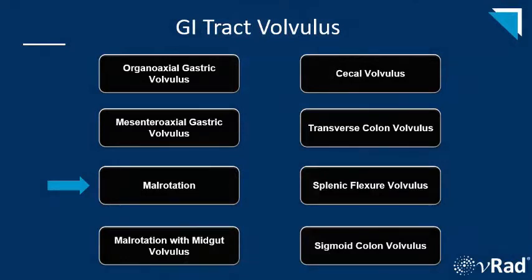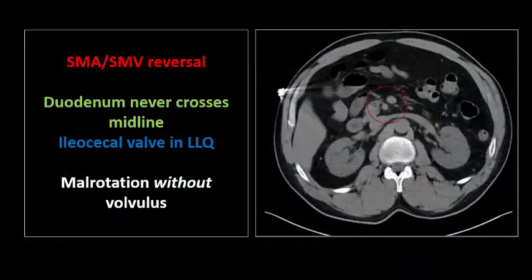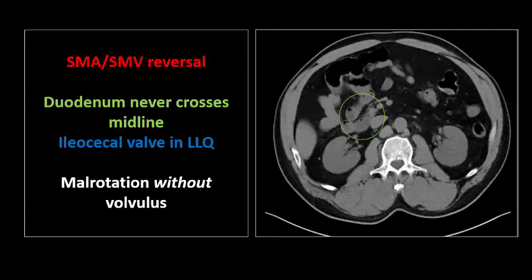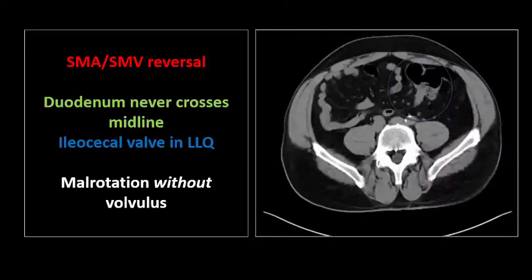Now we'll move on to the small bowel. Since malrotation is the major predisposing factor for midgut volvulus, I wanted to review those findings. Here's a classic example of bowel malrotation seen incidentally on an adult patient on CT. Note the SMA-SMV reversal where the larger caliber SMV is now to the left of the smaller caliber SMA. I want to encourage everyone to specifically follow the stomach and duodenal C-sweep on all patients, and here we see that the duodenum never crosses the midline. Note also that the ileocecal valve is in the left lower quadrant. If you're specifically looking for the appendix on everyone — which you should be doing — and can't find the cecum in the right lower quadrant, this can be the first tip-off for bowel malrotation. It's important to note this anatomy on everyone because although malrotation is congenital, volvulus can occur into adulthood if not corrected.